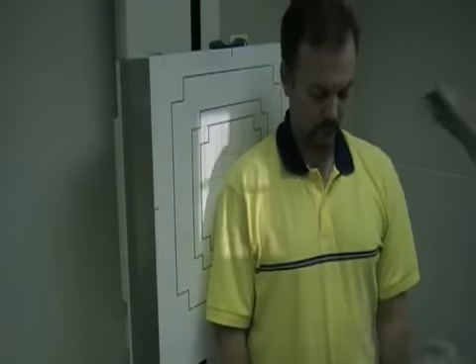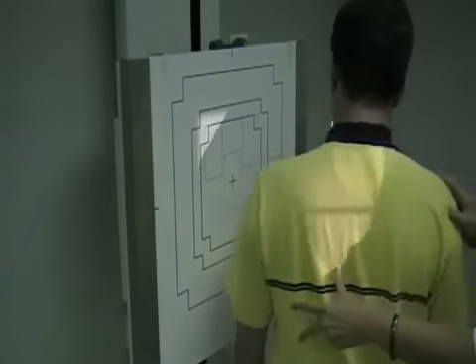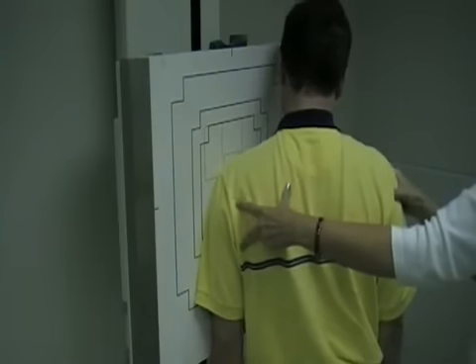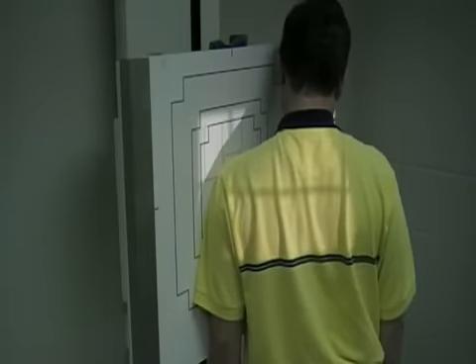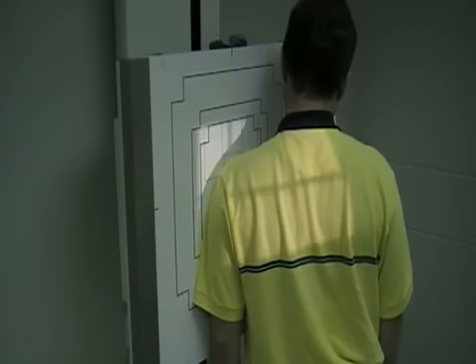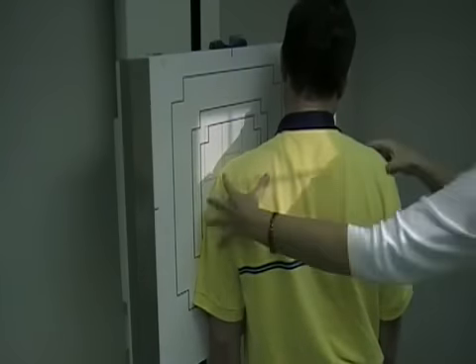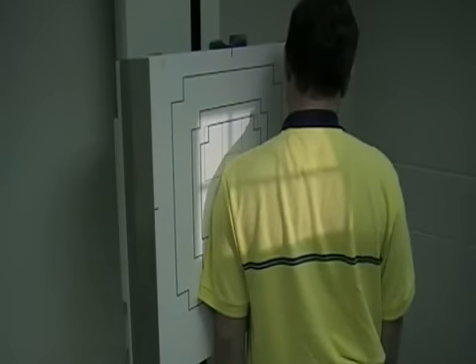Alright, our last special projection is the Neer method, and I'm going to do the left shoulder for this, and I'm going to have David turn, and we will have him in a PA oblique. And you can do a body oblique of 45 to 60 degrees. You're going to have a tube angle of 15 degrees caudal. This is really a tangential projection, and it's going to be skimming over the top of his shoulder.